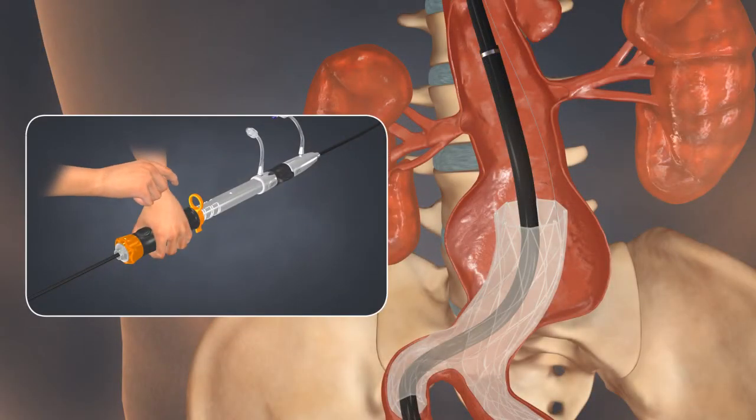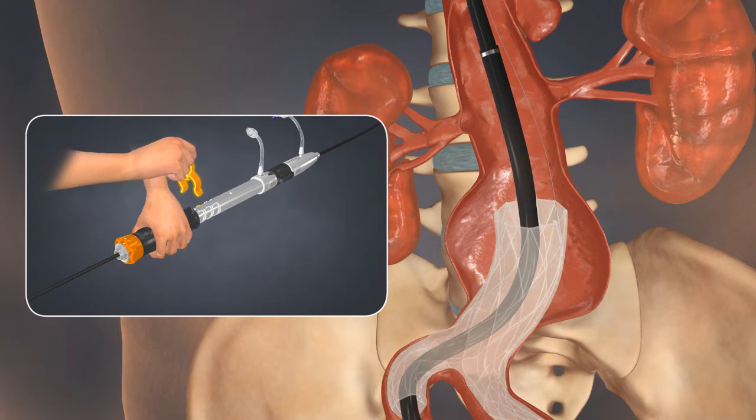With the delivery system at the desired location, remove the safety clip. Now you are ready to deploy the aortic extension.